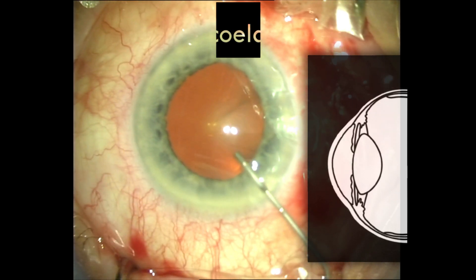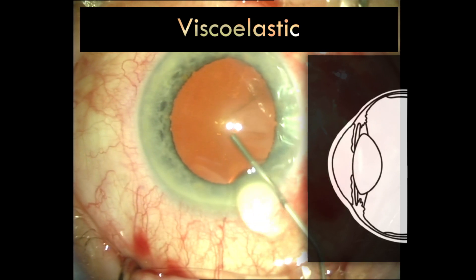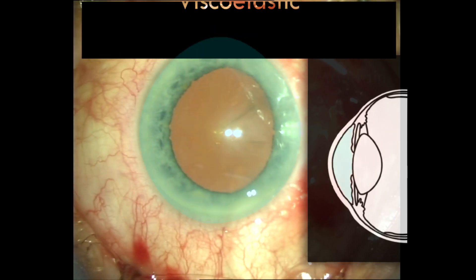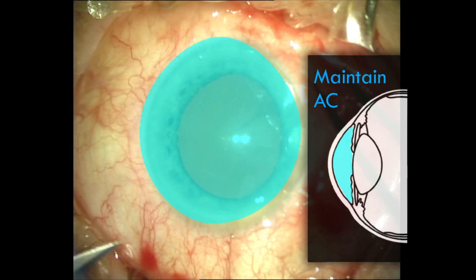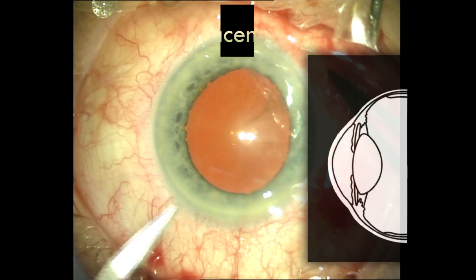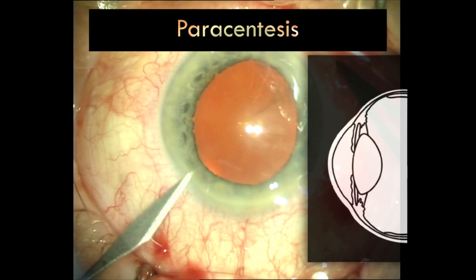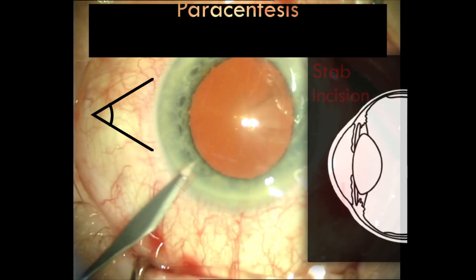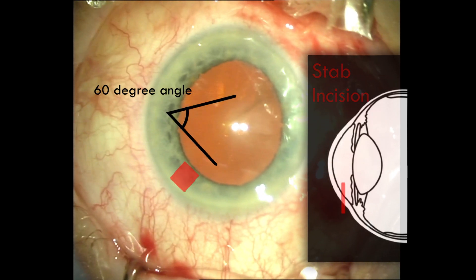I next fill the anterior chamber with viscoelastic. This is a biopolymer which creates and maintains the space in the anterior chamber. I also make a second side-port paracentesis, and this is for my second instrument. It's a smaller stab incision and I tend to put it about 60 degrees from my main corneal incision.